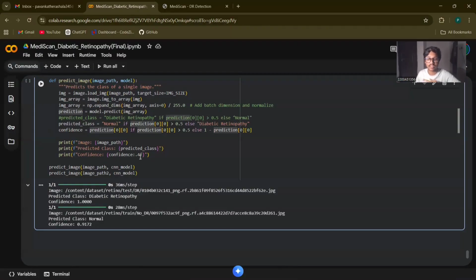So if the probability is greater than 0.5, the model favors the normal class. If it's less than or equal to 0.5, it favors diabetic retinopathy. So we calculate the confidence by always taking the probability of the predicted class. This ensures the confidence always reflects how certain the model is about its final decision.